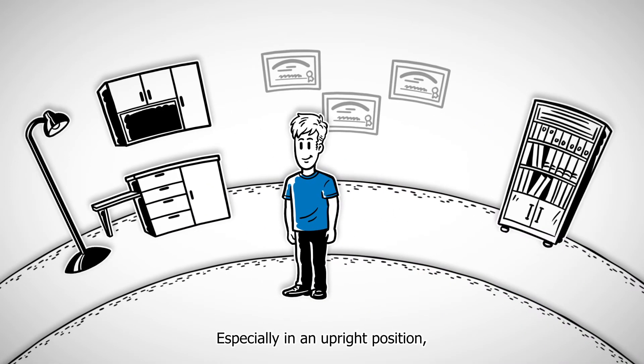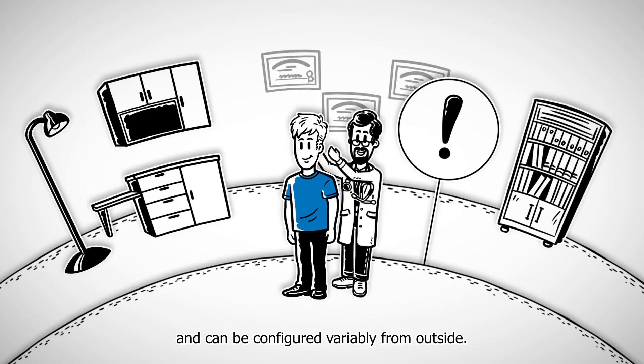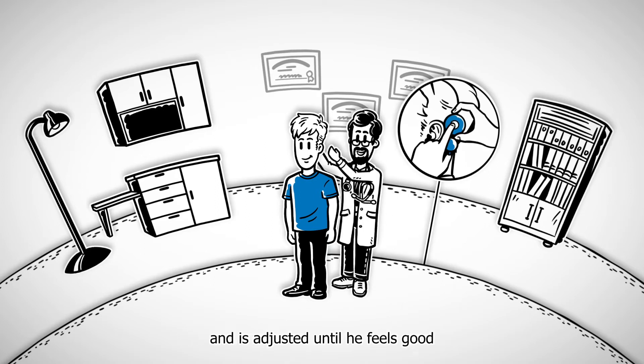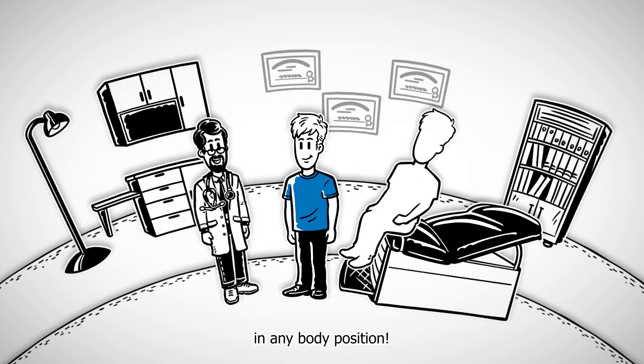Especially in an upright position, this flow rate is crucial and can be configured variably from outside. It fits comfortably behind Tim's ear and is adjusted until he feels good in any body position.